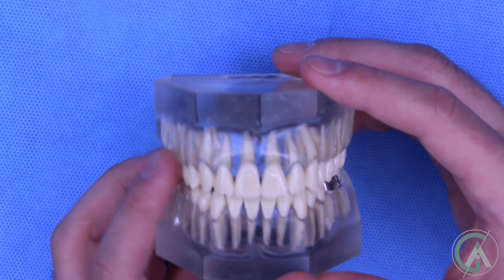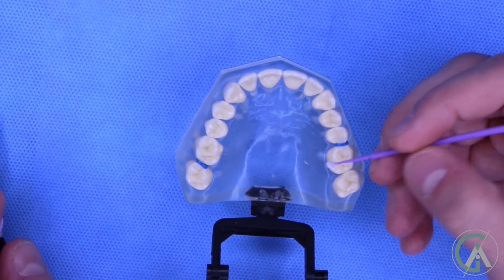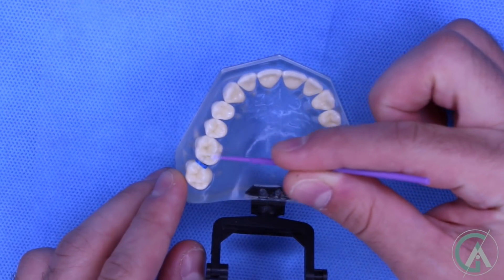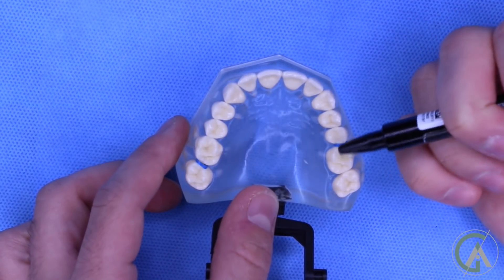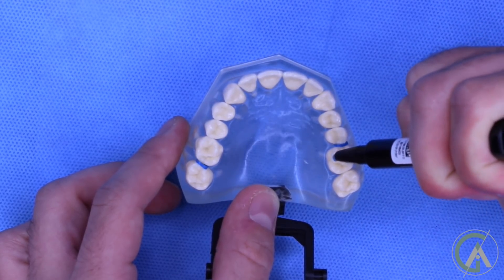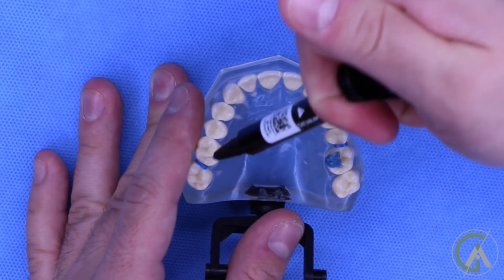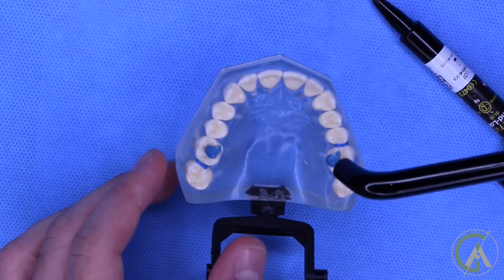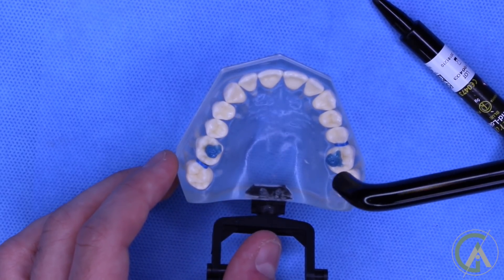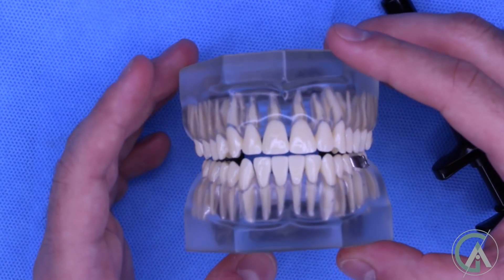Let's take a look at how Bite Turbos are placed on your back teeth. Let's say this patient has a deep bite and we want to put Bite Turbos to help open up the bite. We can place Bite Turbos on the back molars on both sides. We prepare the surface using the materials necessary and we usually put it on the cusp, which is the bump of your tooth. Next, we will dispense it using a material like this — don't worry, this is not a shot, it's just a way of dispensing the Bite Turbo material — and shape it using a brush. We'll do this on both sides, and then cure it using a blue light that you shouldn't look at. On the video screen it's okay, but in the dental office make sure not to look at this bright blue light. With this on, you will now not be able to bite down all the way and not break off the lower brackets.